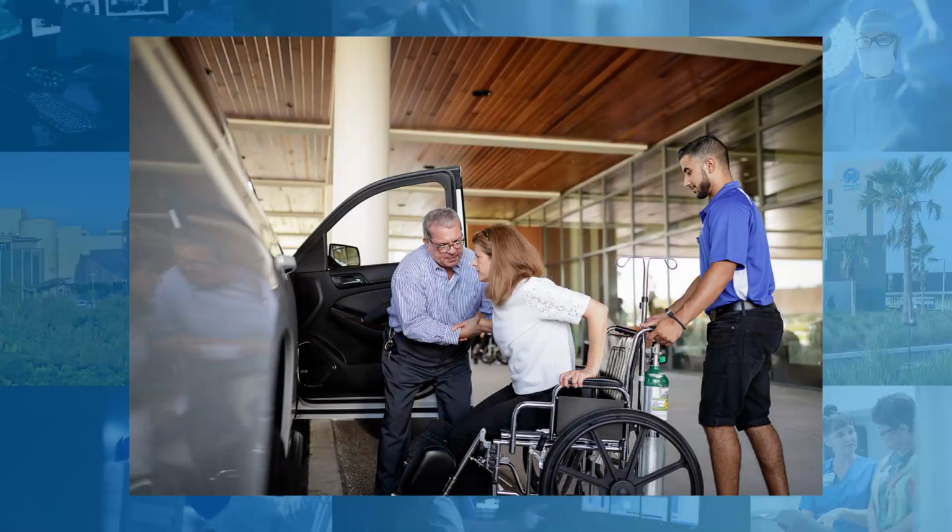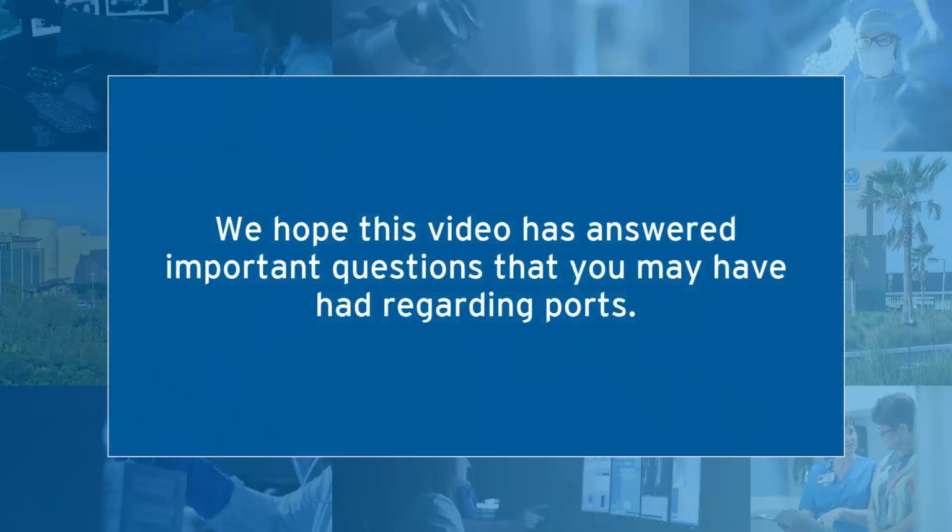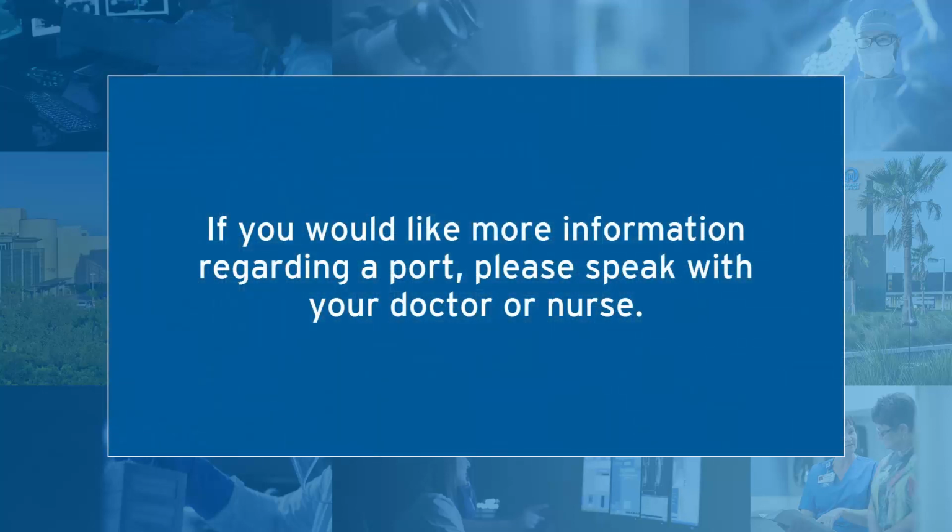You will receive sedation during the procedure, so you will not be able to drive yourself home. For your safety, you must have a caregiver available for up to 24 hours after you have received sedation. We hope this video has answered important questions that you may have had regarding ports. If you would like more information regarding a port, please speak with your doctor or nurse.